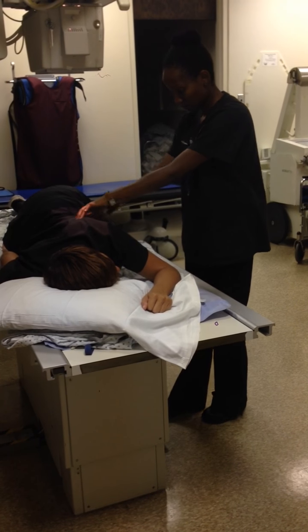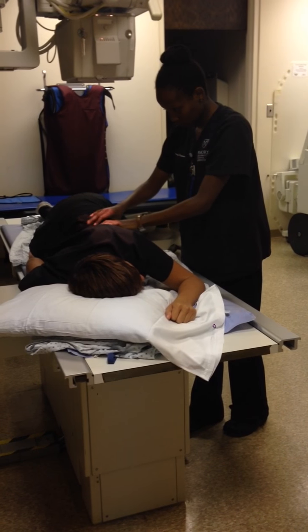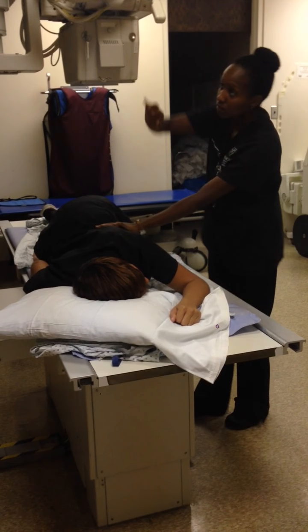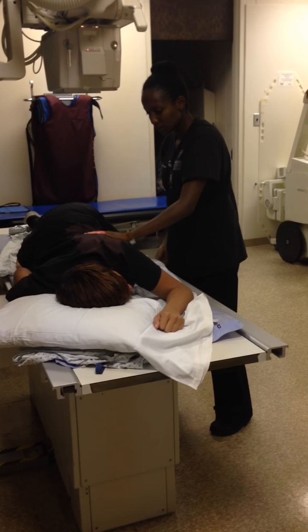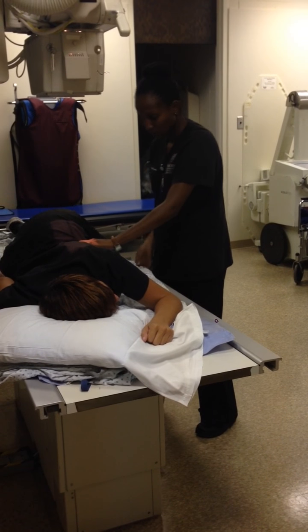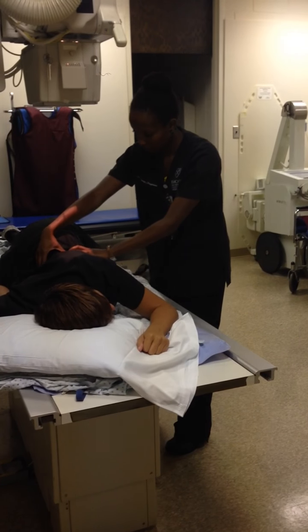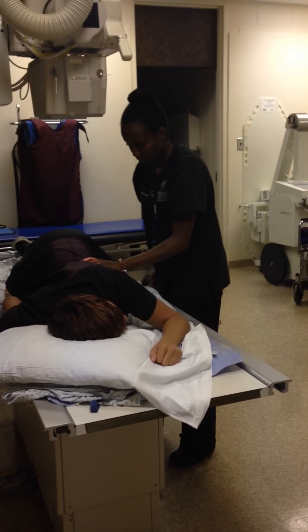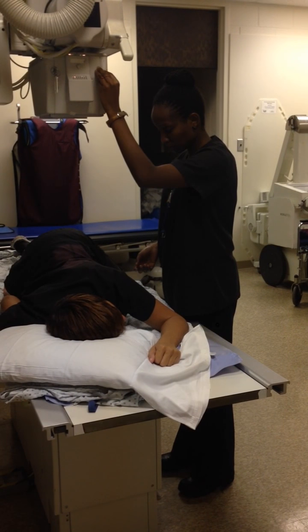For this exam, the centering point is at the pylorus of the stomach and the central ray is perpendicular to the image receptor. To locate the pylorus, the technologist will need to find the lower margin of the patient's ribs on the left side of their body and then center 1 to 2 inches above that. From this position, to center left to right, the technologist will go halfway between the spine at MSP and the elevated lateral border of the abdomen. Place the left marker on the lower corner of the patient's left side in the collimated field. Next, make sure that the source to image distance is 40 inches.